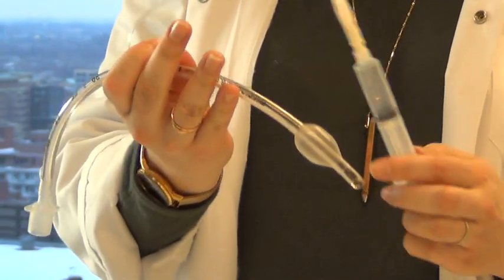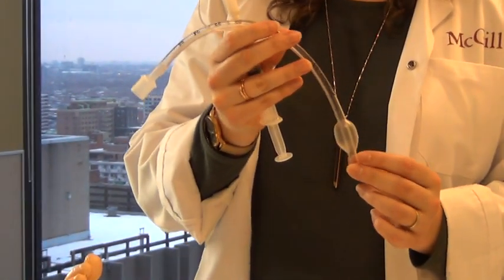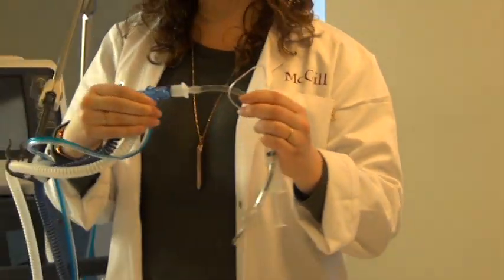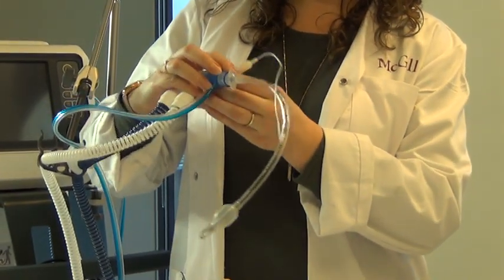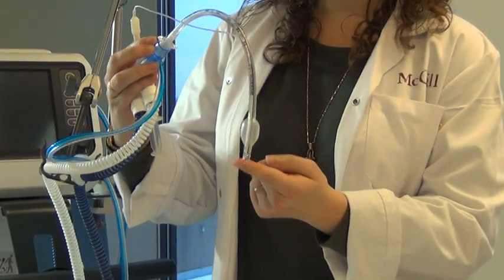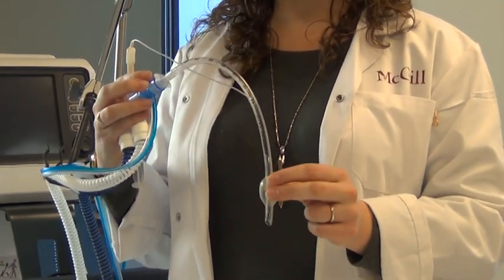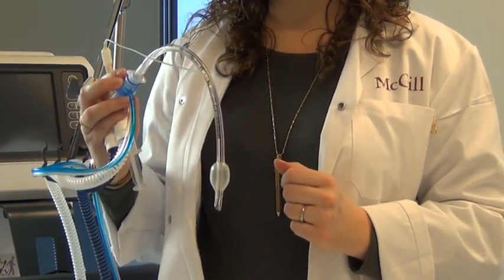Now, the purpose of this balloon is, some may think, to secure the tube and to ensure that it does not come out of the airway, but that's actually not the case. What ends up happening is that the ventilator will come and connect right here. And the ventilator will push air, so positive pressure, through this tube and will come out here down into the lungs to ventilate the lungs. What this balloon ensures is that the air does not come back out around this balloon. Otherwise, our patients will not be getting the treatment that they require with this mechanical ventilation.